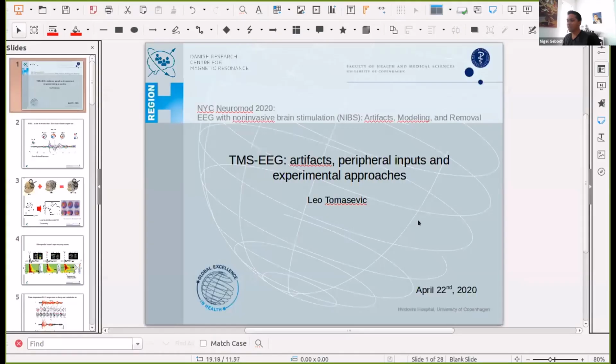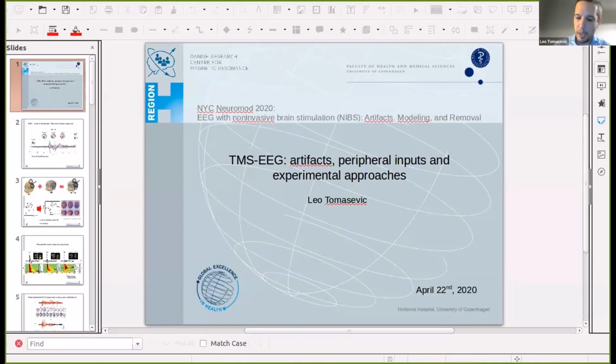Yes. Thank you for organizing this and for making me part of it. I will change the topic a little bit. I will jump from TACS and TDCS to TMS, but I will keep talking about EEG and the artifacts. I'm a research fellow at the DRCMR, a research center at the University of Copenhagen Hospital, and I'm working mainly with EEG and everything related to it.